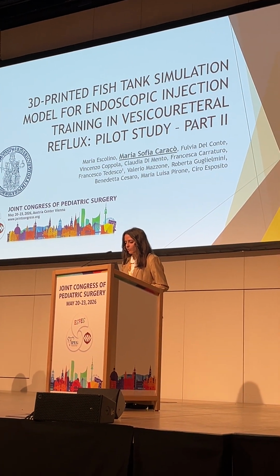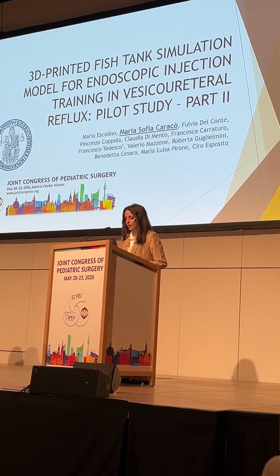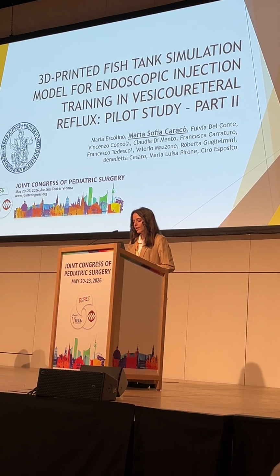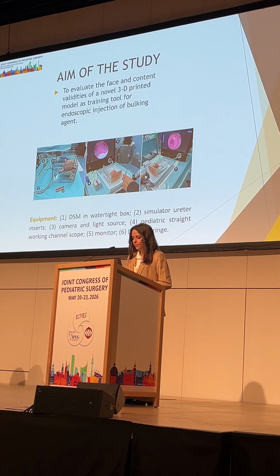Today I'm going to present the fish tank simulator, a training tool to learn how to perform the endoscopic treatment of pediatric vesicoureteral reflux. This consists in injection of dextranomer hyaluronic acid in the submucosal area of the ureteral ostium. I have nothing to disclose.